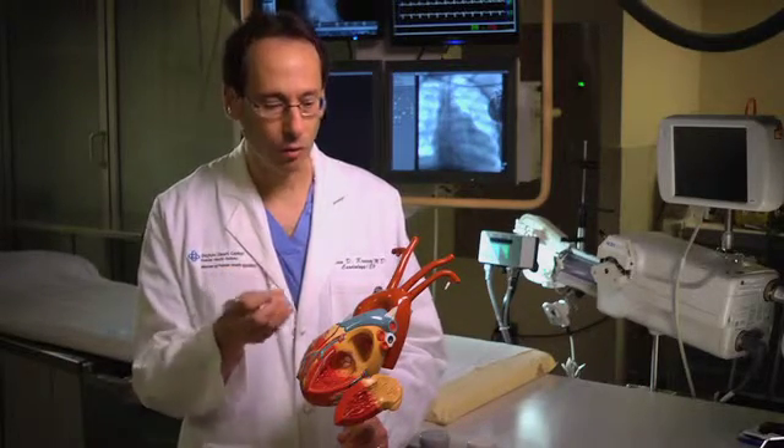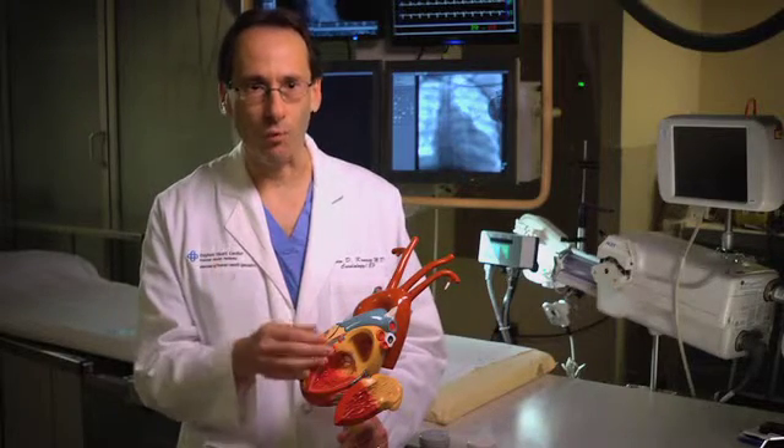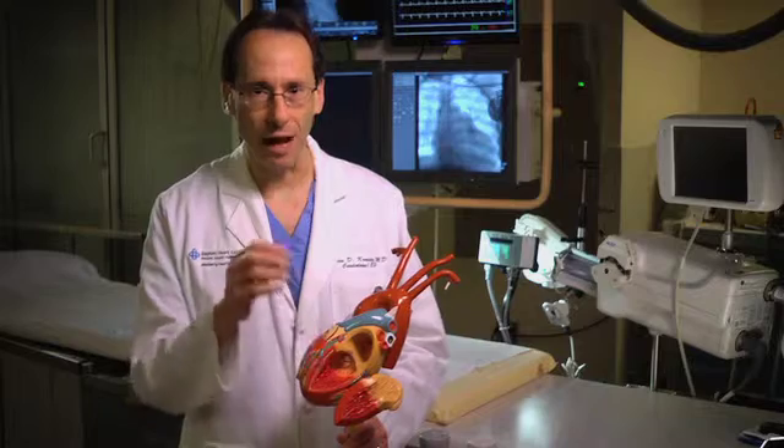Cryoballoon ablation uses a balloon catheter that fits into the vein and is blown up with liquid nitrous oxide, and it freezes around that vein all in one shot. It's a lot easier to do, it's a lot faster to do, and it has a long-lasting result.